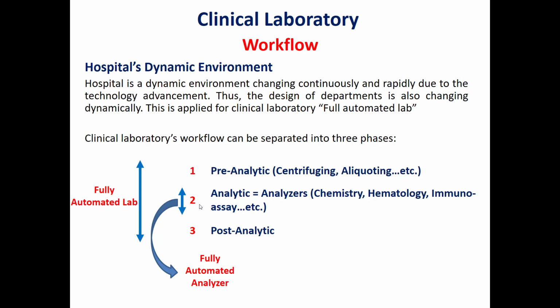In the old clinical laboratory environment, the only automation was related to the analytic phase, to the analyzers. We have different types of analyzers: chemistry analyzer, hematology analyzer, immunoassay analyzer, coagulation analyzer, blood gas analyzer, and so on.